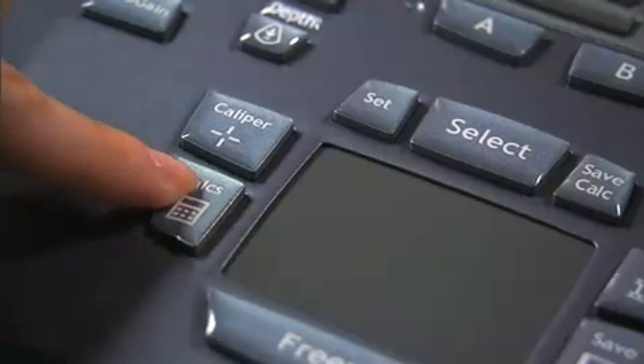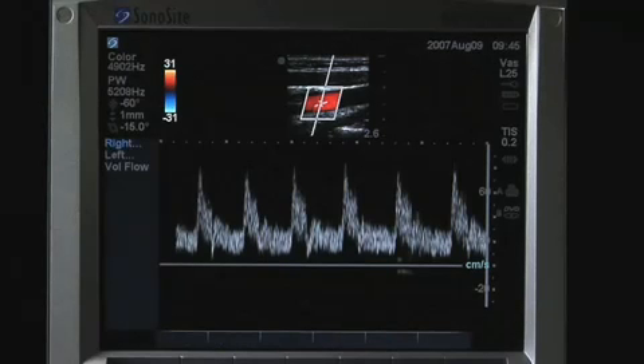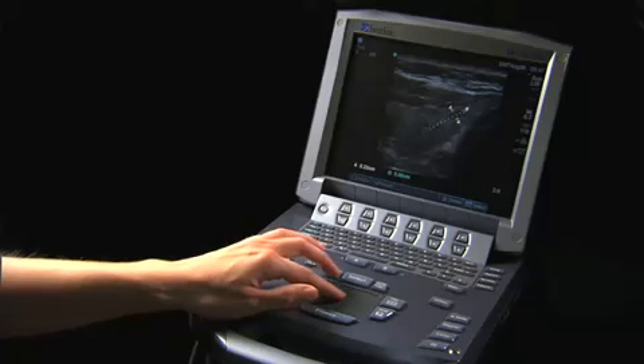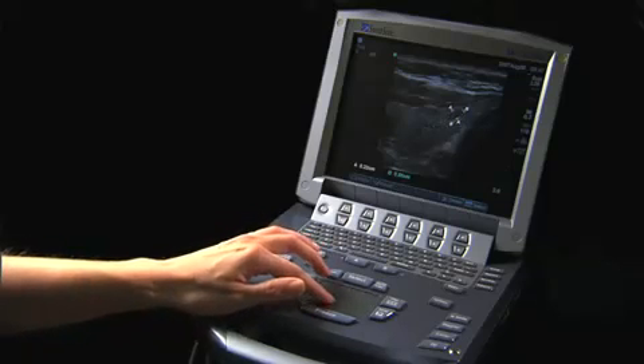The Calc key turns the calculation menu on and off. The menu displayed is determined by the transducer selection and exam type chosen. The generic caliper button activates up to eight sets of calipers on the screen, and from this menu, area measurements may also be selected.